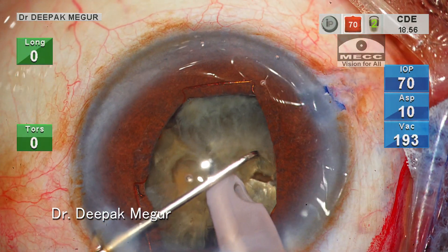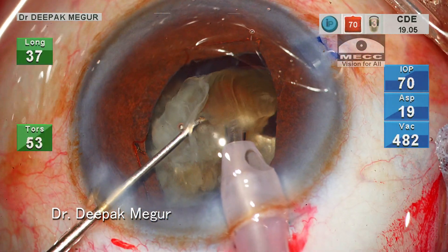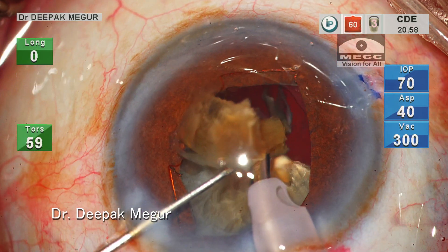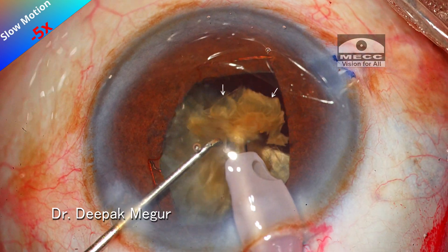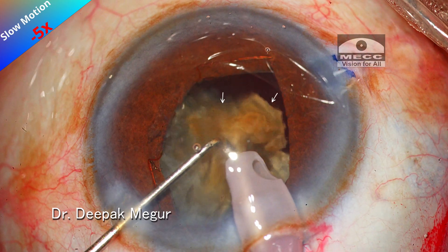I'm emulsifying this loose fragment now. I can see that this fragment has moved up slightly above the pupillary plane — it was slightly more closer to the corneal endothelium, and there is also a significant amount of lens chatter which is clearly appreciated in the slow motion clip. Note that the plane of emulsification is quite anterior.